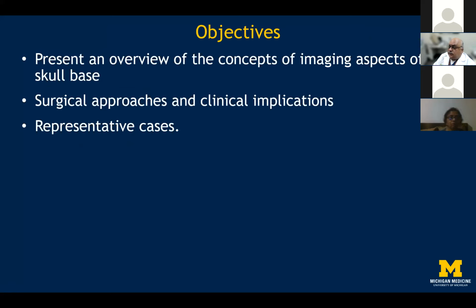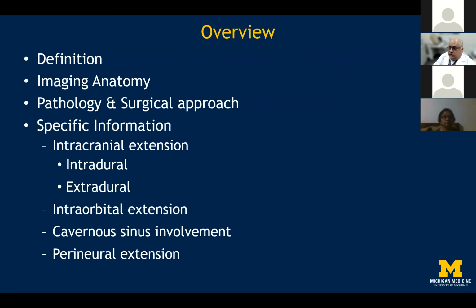So the objective of this lecture is to present an overview of the concepts of imaging of the skull base and to just give an introduction to the surgical approaches and the clinical implications of what we see on images. And then we'll end with some representative cases which I had shared with you earlier.